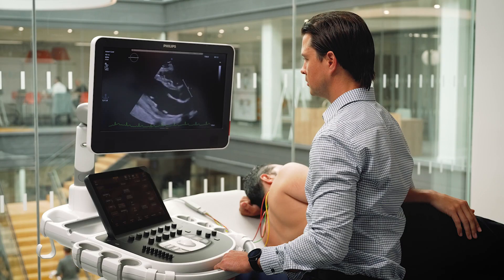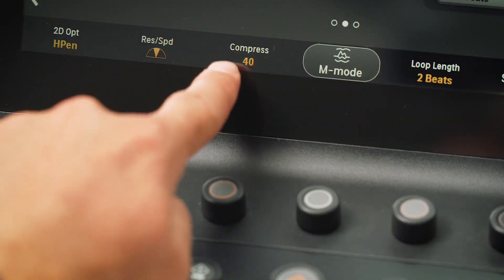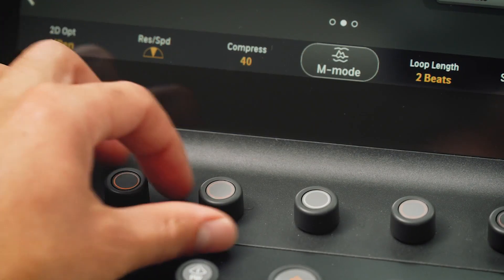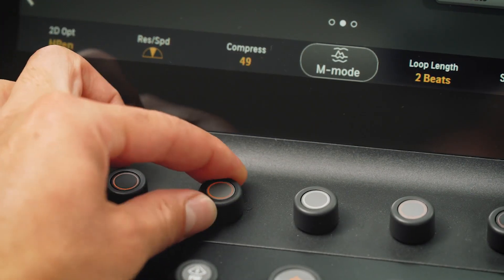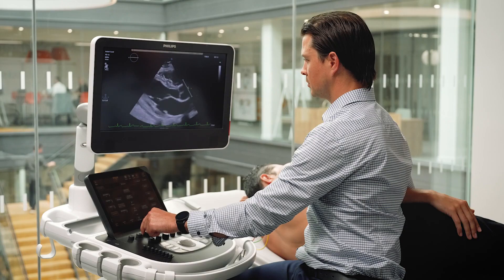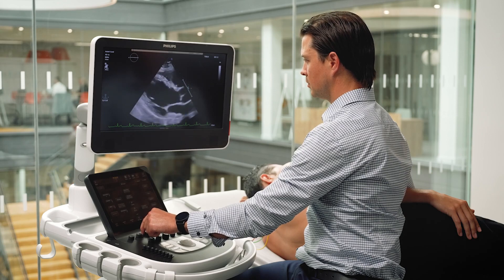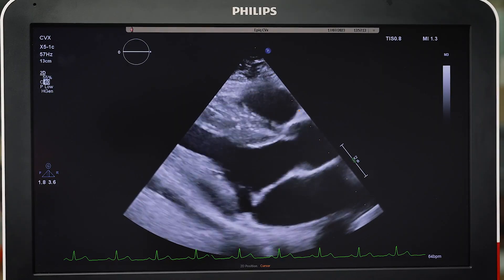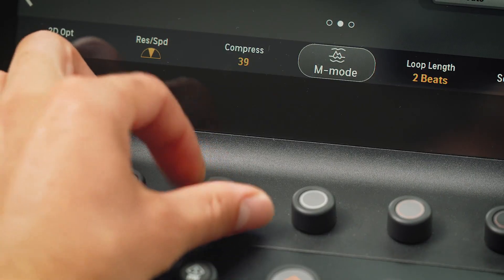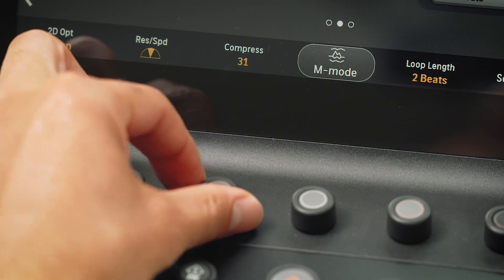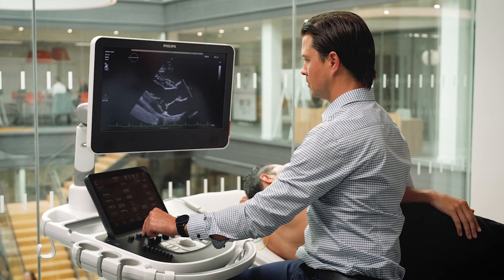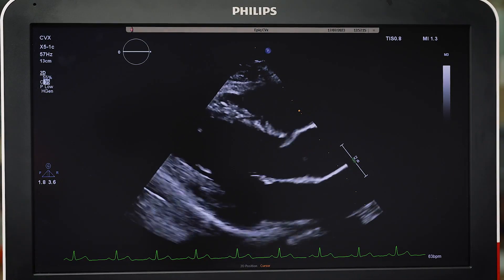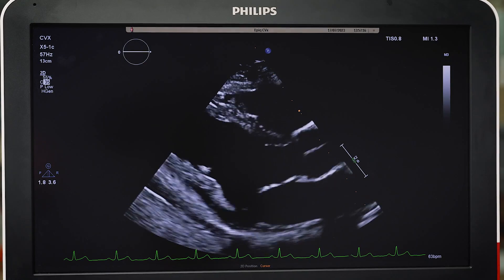Compression can be found on the rotary dial under the touchscreen. By increasing compression, more shades of grey are used in the image formation, resulting in a softer image. In contrast, reducing compression results in fewer shades of grey and a more black and white image appearance.